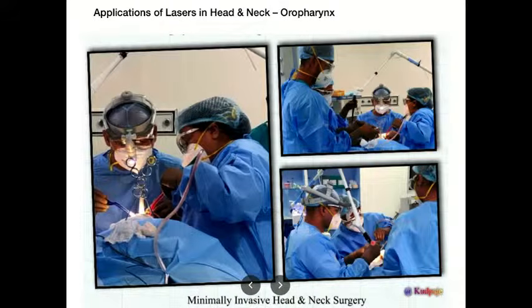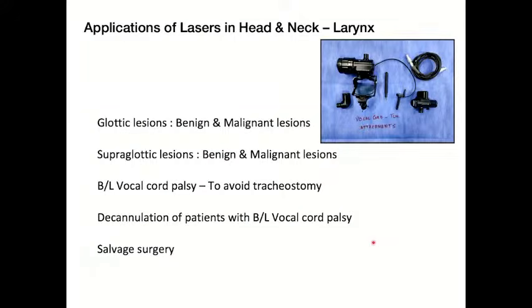Using longer applicators, you can use it for tonsillar, again very superficial lesions of the tonsil, leukoplakia, or in snoring surgeries also it can be used. And the cutting tool was a laser. This is just to show that it can be used, but there are better tools to do tonsil and oropharyngeal surgeries than laser. But it's just for completion I am discussing.